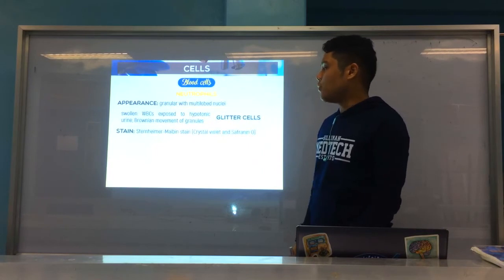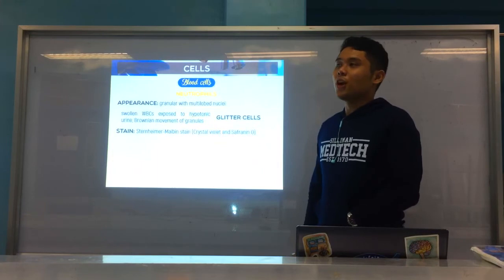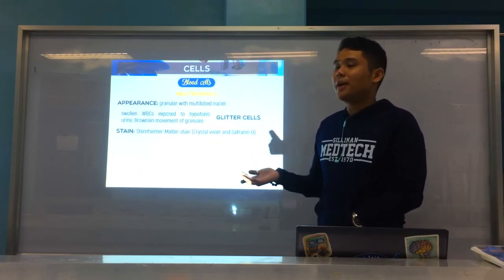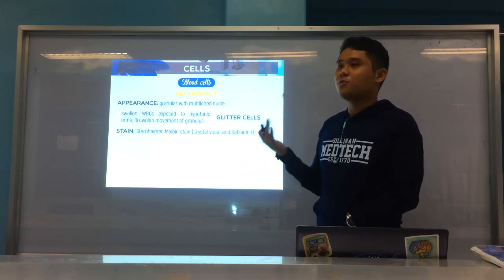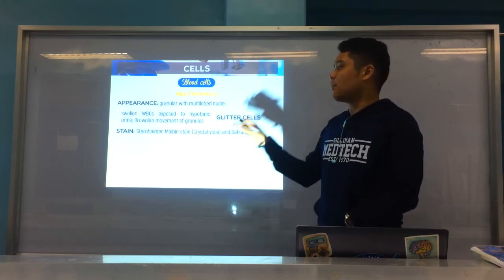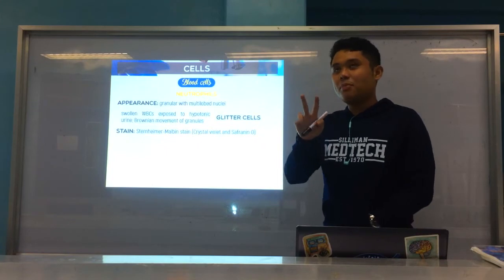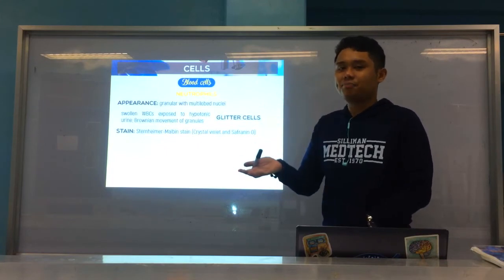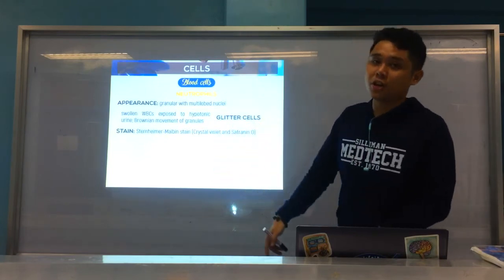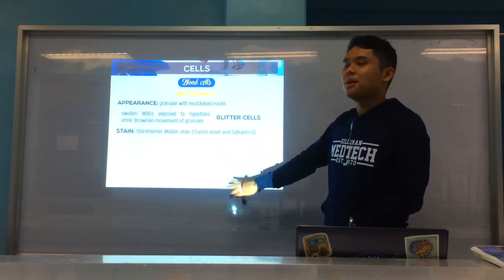And we have what we call your stain, Sternheimer-Malbin. In your Strasinger, there is also a table for all the stains used. Usually, staining in the microscopic exam is done for confirmation or further identification if you are not very sure. That will be in your lecture, but we will introduce some stains depending on the cell. For neutrophils, we use Sternheimer-Malbin, usually a general stain for microscopic exam.